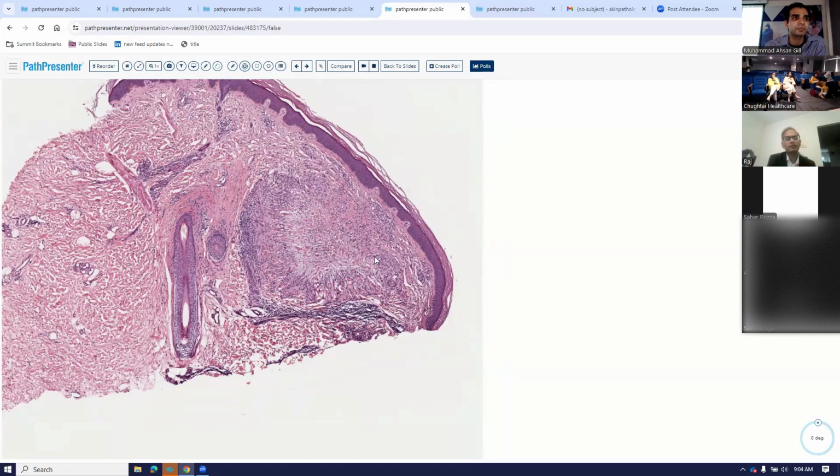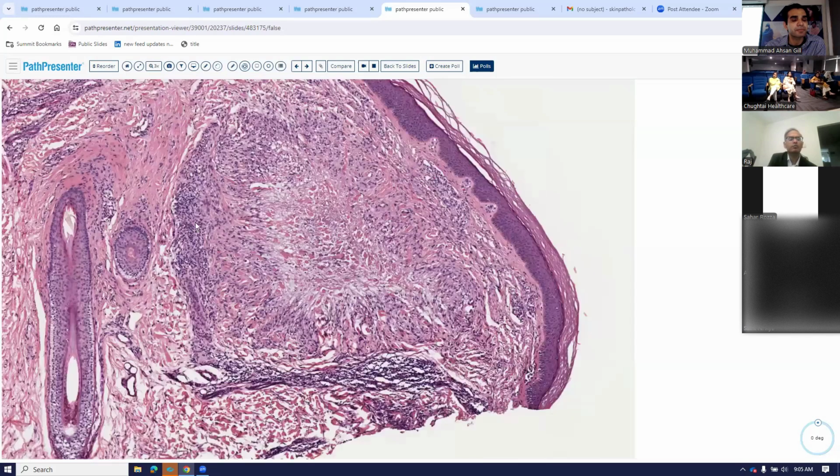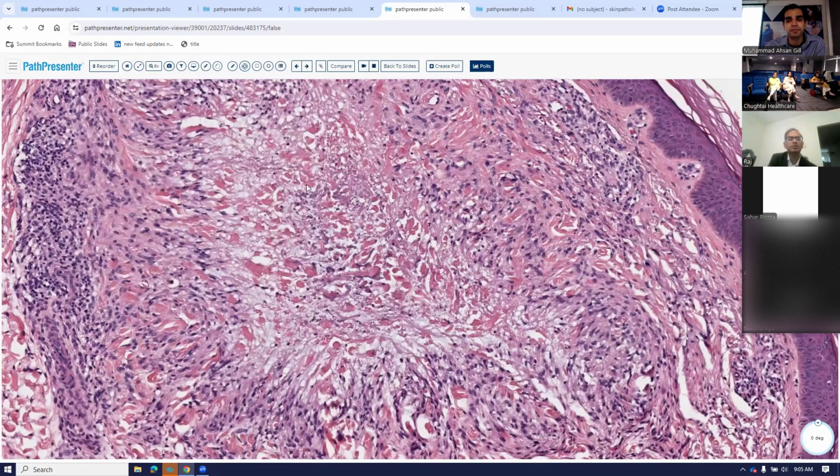And in the skin, if you see macrophages, many times it is termed a granulomatous dermatitis. Remember, in other parts of the body, we talk about giant cells as being part of a granulomatous reaction. In the skin, whenever you see a lot of macrophages, people will tend to call that a granulomatous dermatitis. Now, this is forming a palisade or a fence or a round lesion, and that is the reason this is known as a palisaded granulomatous dermatitis. So this palisade is composed of lymphocytes and macrophages. And when you go a little bit higher power, it is enclosing this degenerated collagen.